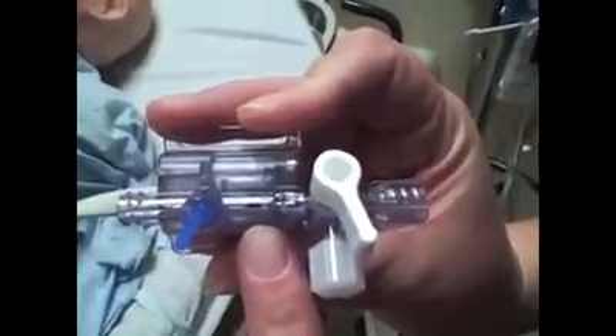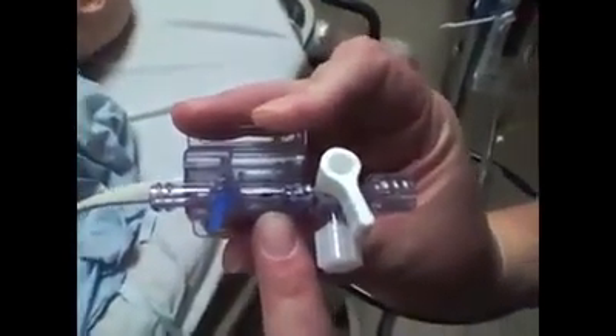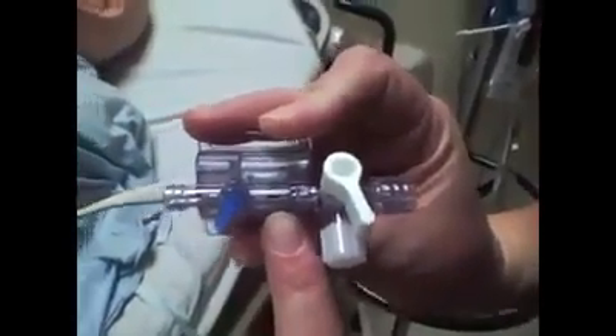Remember that the little black spot in the middle is the actual transducer — that's what does the measuring, so this is the part you make sure you're leveling. We also cut off the blue cap because it's used to flush the system, and we never want to flush the system with IV fluids, so we cut it off so it's not there.